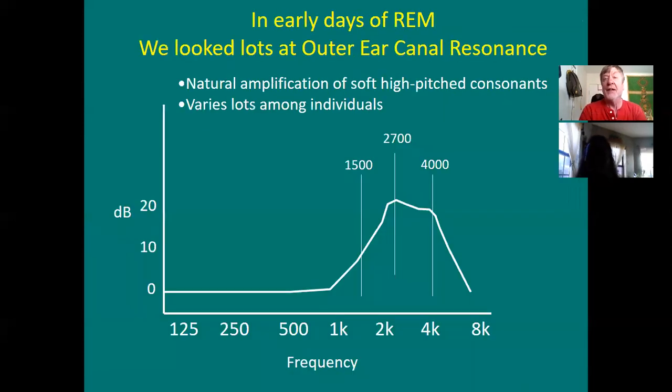Okay. With early real ear, we looked a lot at the ear canal resonance. Lots and lots at that. We don't as much anymore. But I've overgone my time, so I will stop right here. Look at your notes carefully. Next week, we'll go more into today's fitting methods and how they evolved from yesterday's fitting methods.